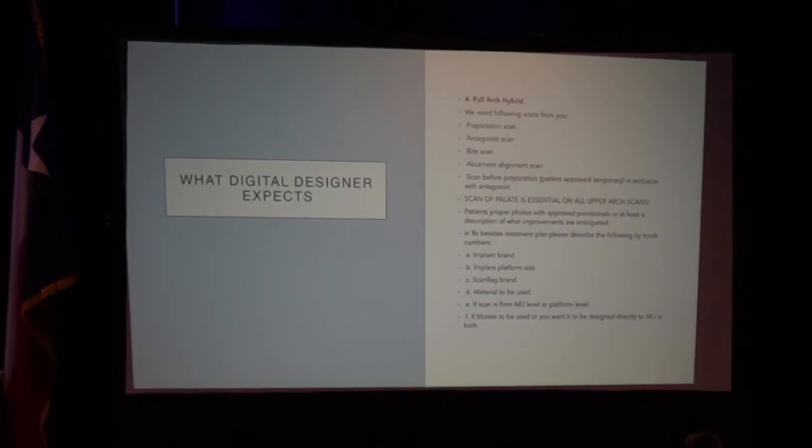Two reasons. When you're getting that wax up and you transfer it, you always want to scan that palate, because when you have your model and you do your putty impression to transfer it to the temporaries, that palate acts as a resting stop. I've taught a lot of dentists, and sometimes I go to offices just to help buddies out, and they're never scanning the palate. And then I tell them these reasons why: one, that's a resting stop, and two, for digital dentistry, that rugae on the top of the palate, we can stitch that and align the bite if anything goes off. I know there's some new dentists in here who maybe didn't understand that part, but even in the old school way where we take that impression, on the bottom there aren't any resting stops, so sometimes it can be a little canted when we transfer the temporaries.